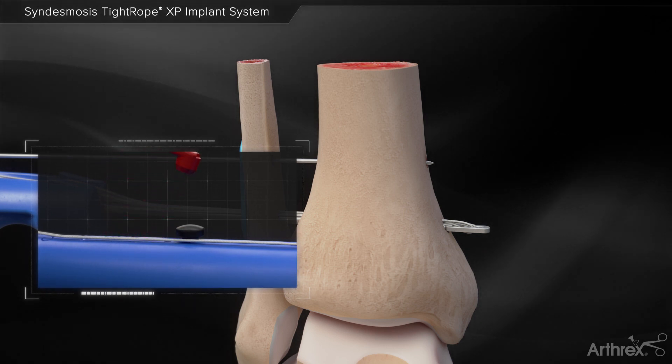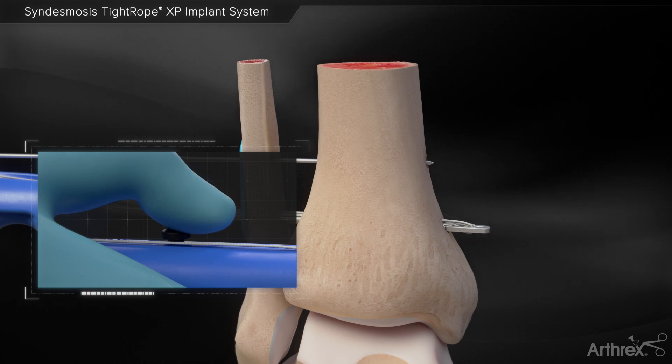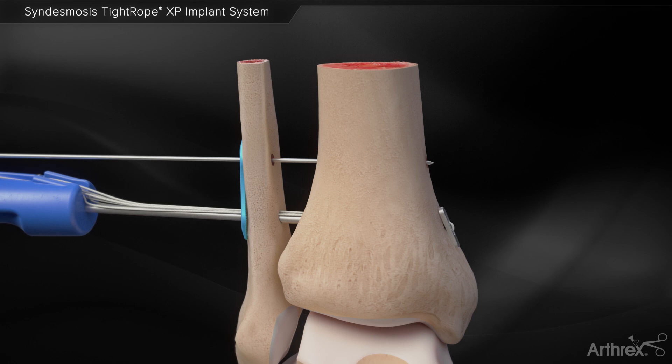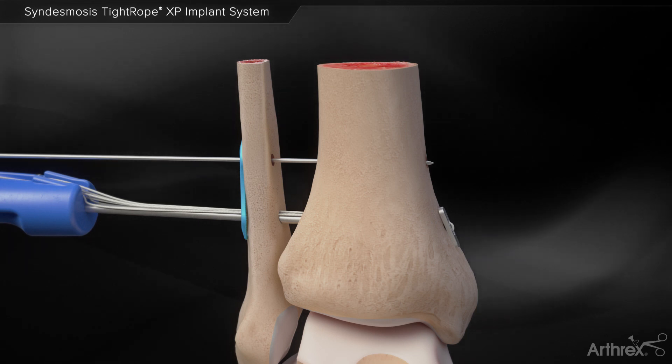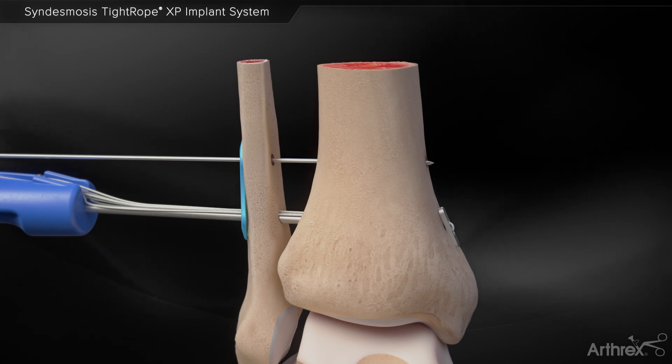Remove the red safety tab. Deploy the black button on the syndesmosis tightrope XP handle. Pull back on the syndesmosis tightrope XP handle to confirm on fluoroscopy that the oblong button is flipped and seated flush against the medial cortex of the tibia.